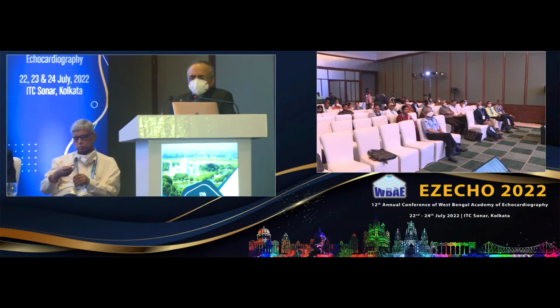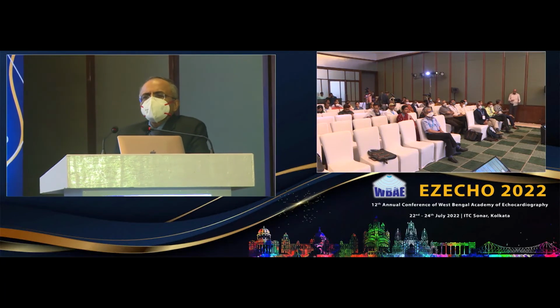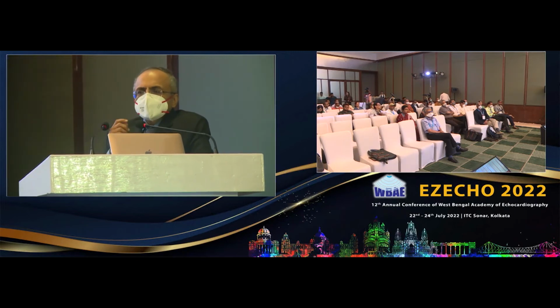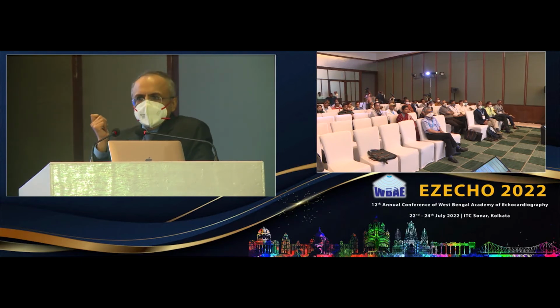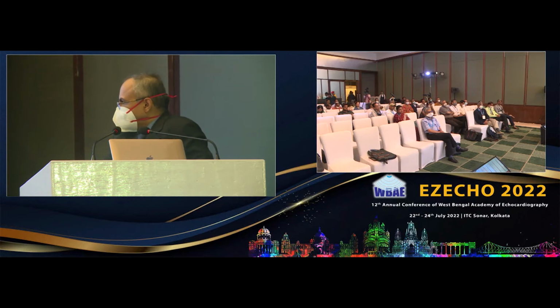which is a work in evolution. Now, what does the extracellular volume tell us, and what is different from LGE? Extracellular volume is the interstitial fibrosis, and now the interstitium has become our second target. All the time we are thinking of myocytes, but the interstitium is another target that we are thinking about, and we already have a drug to affect the interstitium. We have the SGLT2 inhibitors.